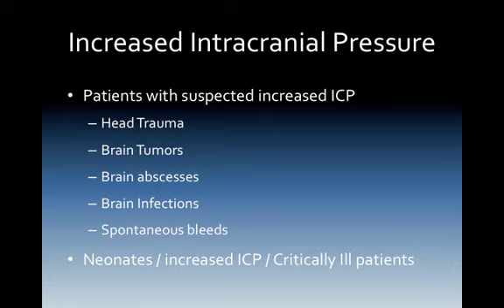So if they're posturing and you have a rapid increase in intracranial pressure, very simply, you could hyperventilate them a little bit and see if it subsides that increased ICP. Don't get extreme with this. Don't take them to extreme ends. So monitor. You want to just adjust it very, very little, towards the lower end, maybe at 35, maybe at 32, 34. Start off with that. See how your patient does and interacts clinically.